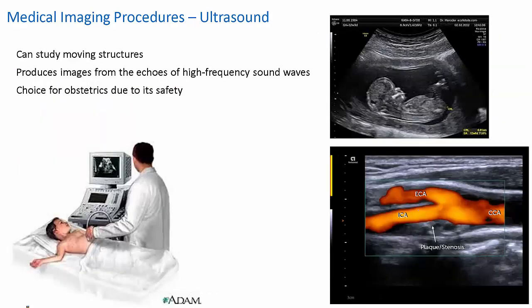Of course, I mentioned earlier that we have our ultrasound tools in the Holly's office, so definitely take advantage of that. Check them out if you'd ever want to get some practice in them. And the beautiful thing about ultrasound is that it's used to measure moving structures underneath the soft tissue. And it's going to use these echoes of high frequency sound waves.